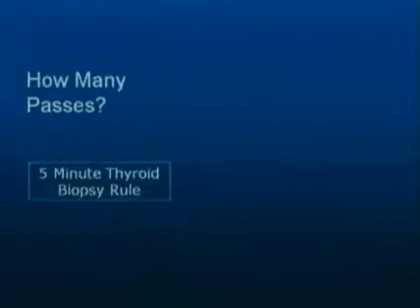Well, what I do, for instance, for thyroid biopsies, I do what is called a 5-minute thyroid biopsy. I sort of have a rule because patients have a lot of discomfort with this if, in fact, you take a long time. So what I try to do is tell the patients, I'm going to do 4 to 5 passes. I will be done in 5 minutes.